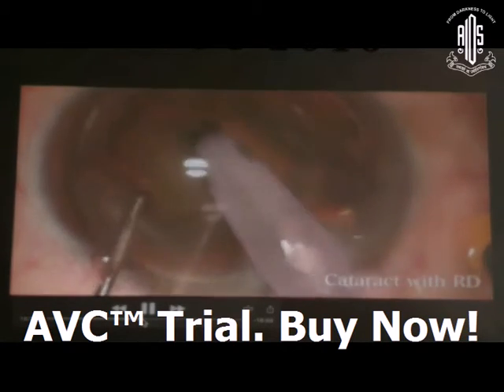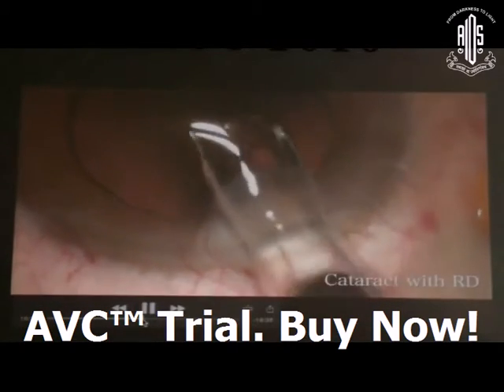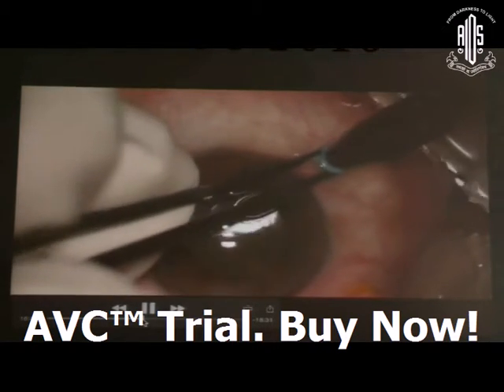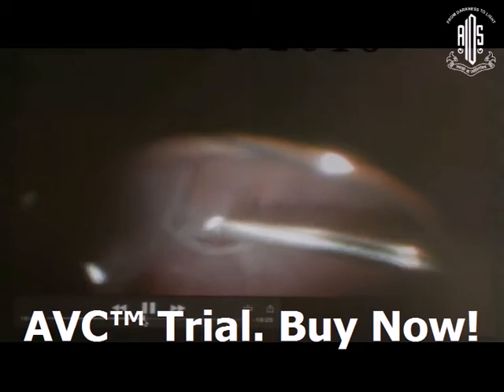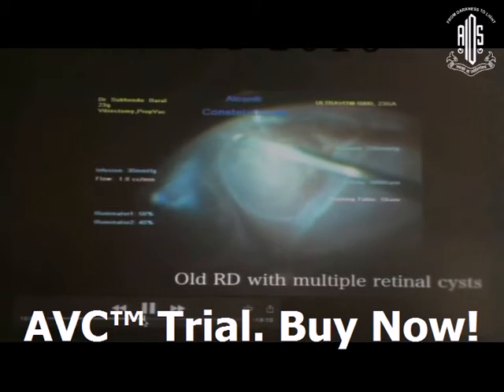Another situation: cataract with retinal detachment is also a very tricky situation. You have to perform phacoemulsification under a grayish glow — you are not getting a good red reflex. After placing the IOL, treat the case as a pseudophakic retinal detachment: do vitrectomy, remove all adhesions around the breaks. An inferior break was there; manage the case as usual.